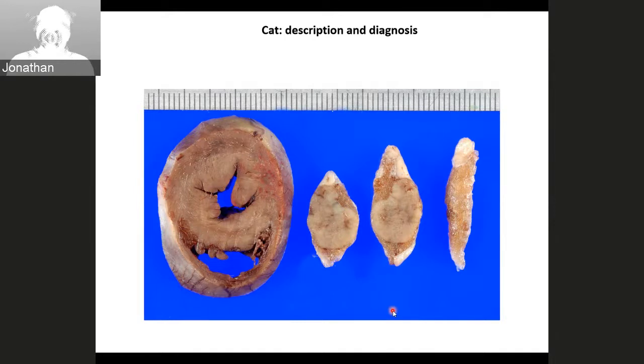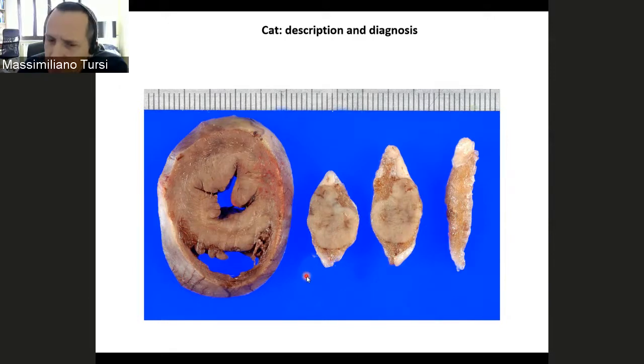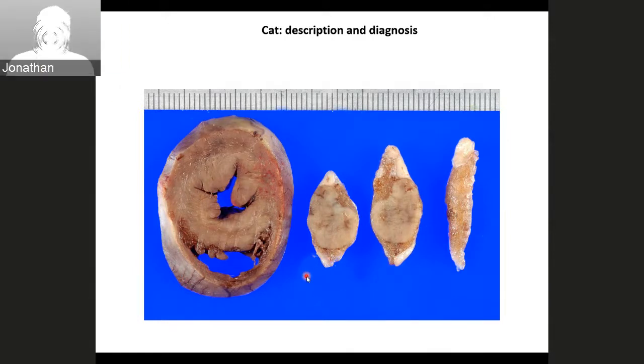And we've got another section that looks like probably something, maybe a wall. No, take care. That's the heart, of course, but the others are not the heart. Oh, okay. All right, let me think about what that can be.